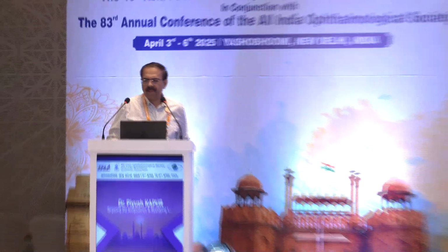Yeah, and one thing is, if the patient has undergone hyperopic LASIK, the conventional spherical lenses will do much better than aspheric lenses in these patients. Yes, the conventional, because in them the cornea is in the opposite direction.